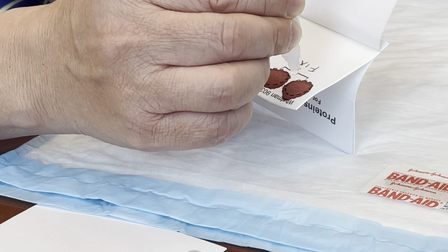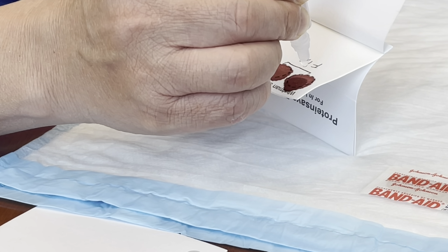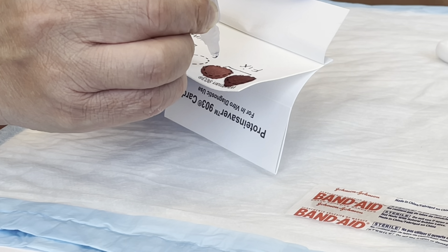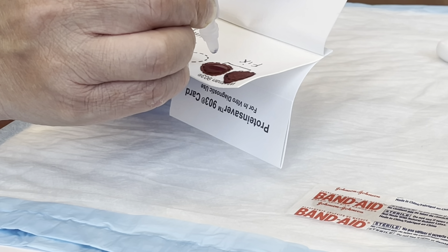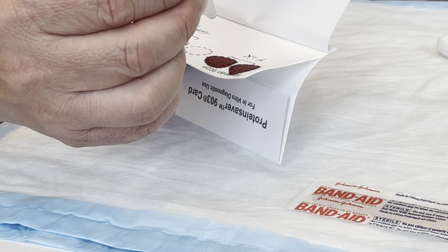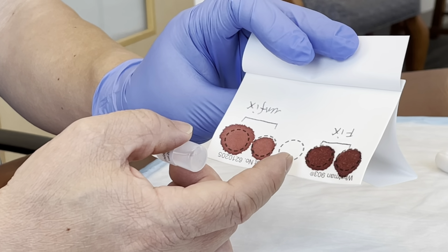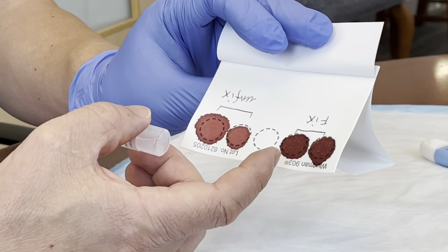Allow a single drop of the buffer to fall directly onto the middle of the blood spot. Add 1 to 2 drops of buffer to each of the 2 blood spots marked Fix. The buffer should soak through the blood spot so that it turns a darker color on both sides of the card. Do not add fixing buffer to the 2 spots labeled unfixed. The analysis of those 2 spots is different.